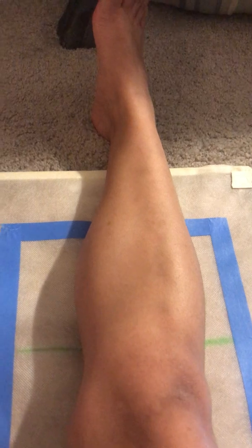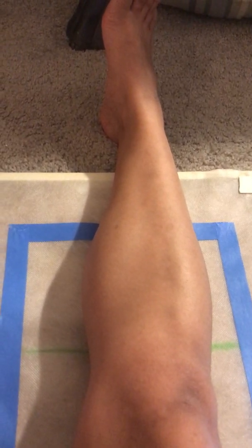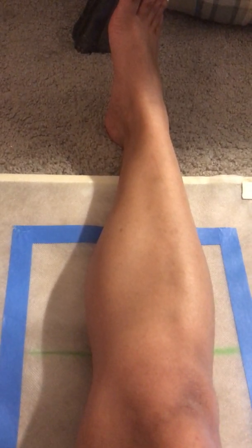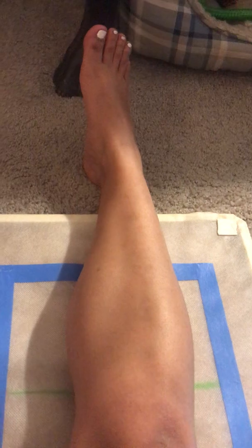For the lateral oblique, instead of internal rotation, you're going to have an externally rotated foot, 45 degrees, going the opposite direction. And in this case, recumbent, you're doing, again, the 3 to 5 degrees of the joint space. And if upright, it is perpendicular to the distal femur and proximal tibia and fibula, but still a half inch below the apex of the patella through the center of the field. So the biggest difference is the internal and external rotation of the foot. Or leg, if you'd like to say.